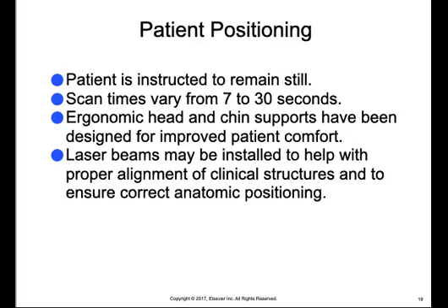As with all imaging procedures, the patient is instructed to remain very still during the exposure of the three-dimensional image. As mentioned earlier, scan times vary from 7 to 30 seconds. Ergonomic head and chin supports have been designed for improved patient comfort. Some manufacturers may install laser lights to help with proper alignment of clinical structures and to ensure correct anatomical positioning. As with most extraoral imaging procedures, patients have an open and comfortable view of the surrounding area.